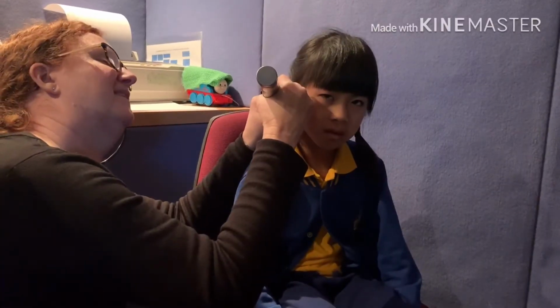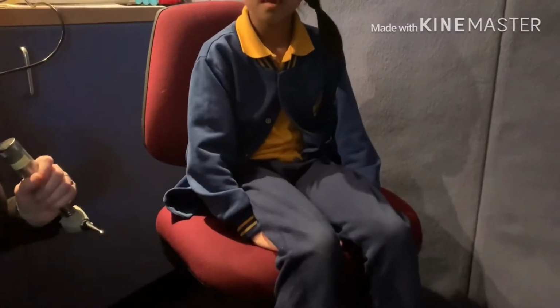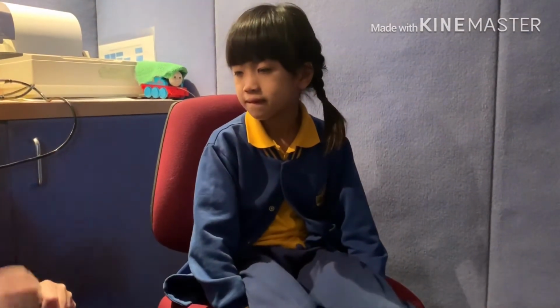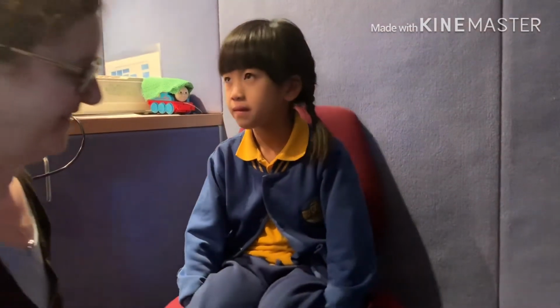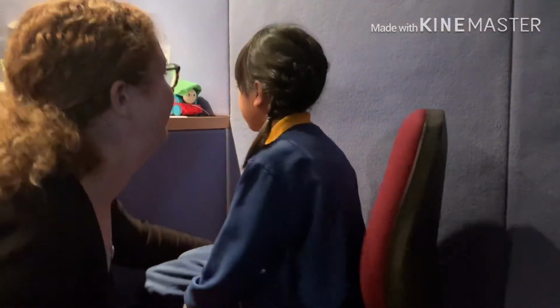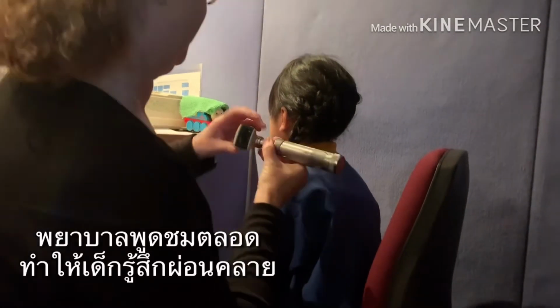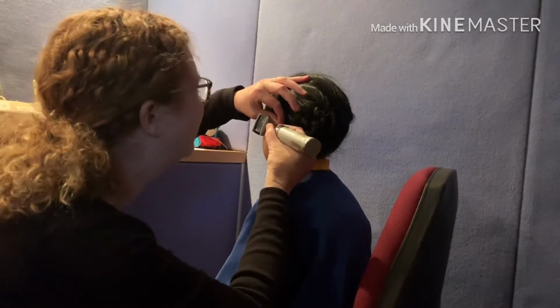Can you see the light? That's the light reflex. That's the incus and the malleus behind the eardrum that you can see reflecting the light. They're the little bones inside the ear. Oh, you're going to move a little bit, right? Yeah, really good. Thank you, Tina. Okay. Can we have a look in the other side? She's really good and still. There's not many patients that you could do this with and get people to look.